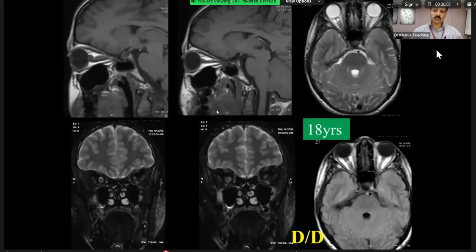Now we have started a section. Till now what we have covered is just miscellaneous things in CNS. It's a mix and match of what we covered today. It was a bit of anatomy, a bit of signals, a bit of sequences on MR. And we have covered how you diagnose, which kind of sequences are in the exam, and what the basic sequences are.